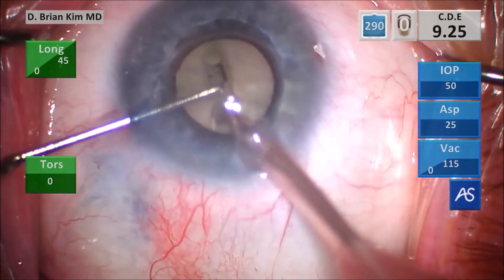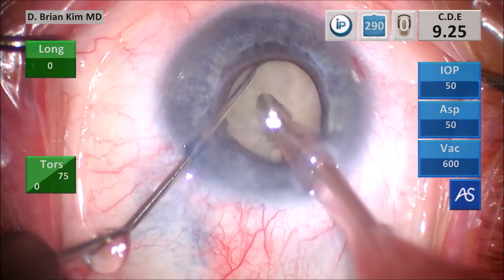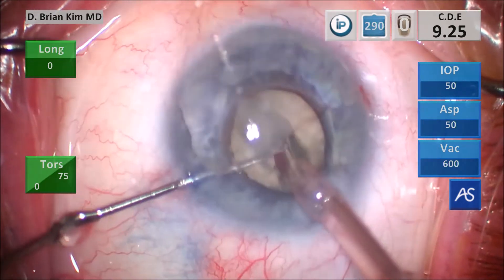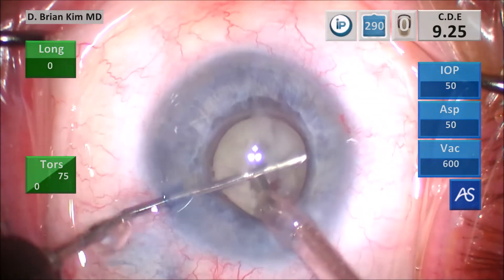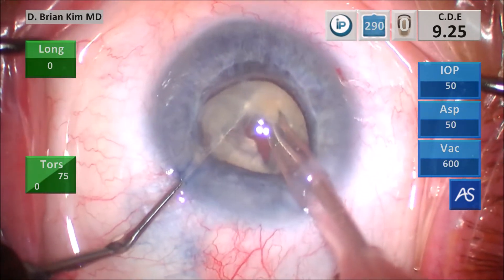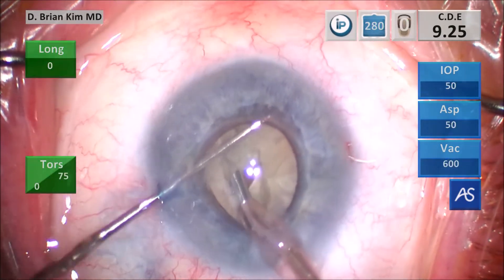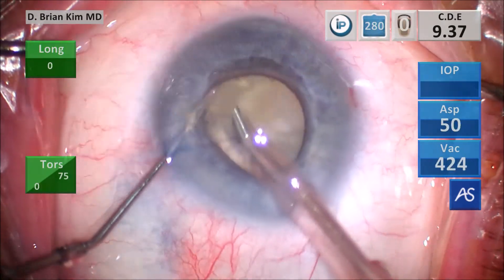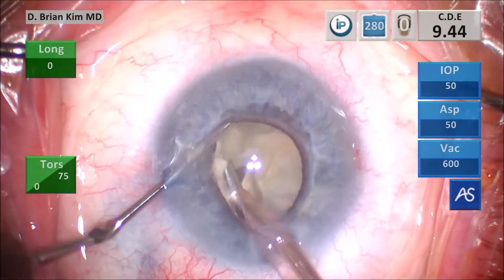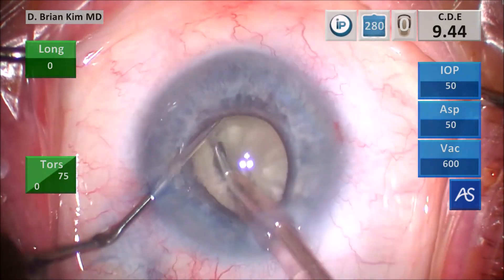Turning the bevel down, switching to quad mode, placing the chopper around the rhexis edge contra-incisionally, fracturing the lens. I'm able to place the phaco tip deep into that groove and successfully fracture the lens completely in half. Placing the chopper around the right-hand nucleus, hooking the peripheral lens, fracturing — that is the cross chop. Placing the chopper around the first quadrant, hooking the peripheral lens, fracturing again — that didn't quite work, so I go ahead and do it again. Separating the pieces and then going after it, lifting that piece up.